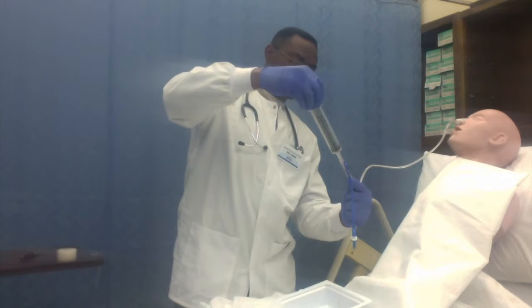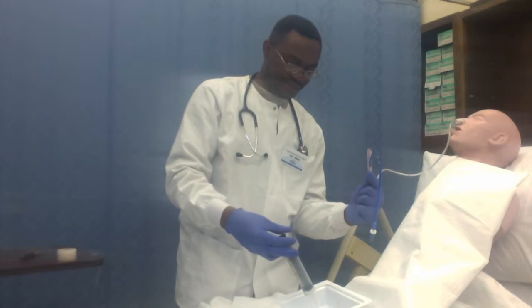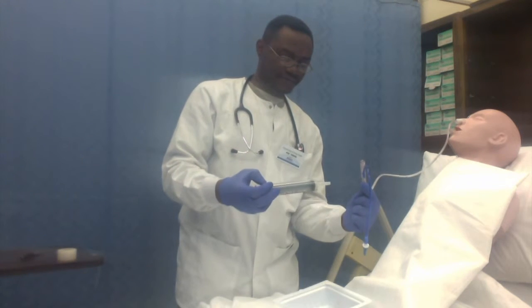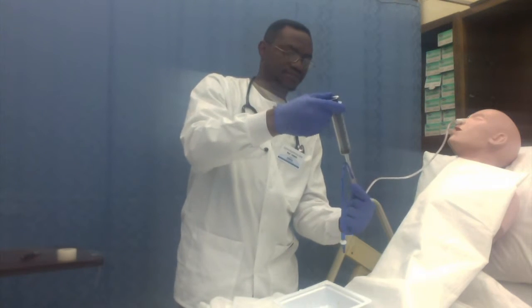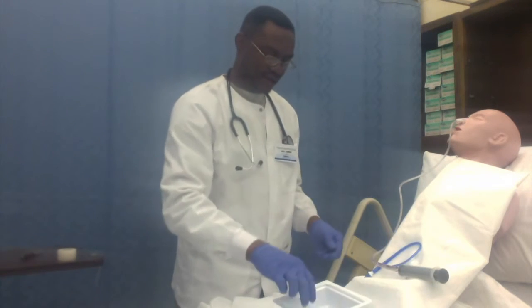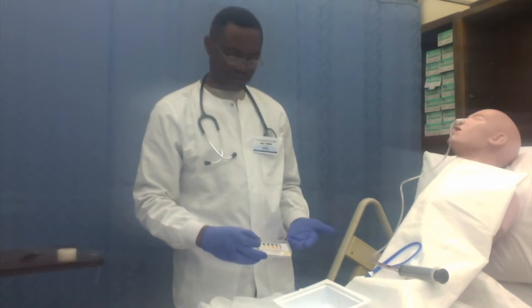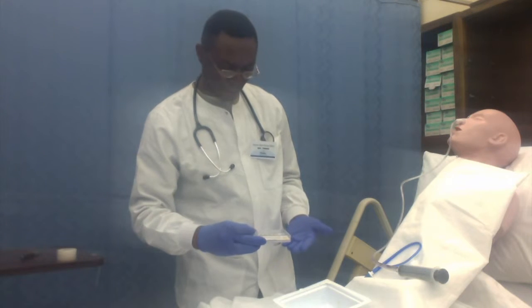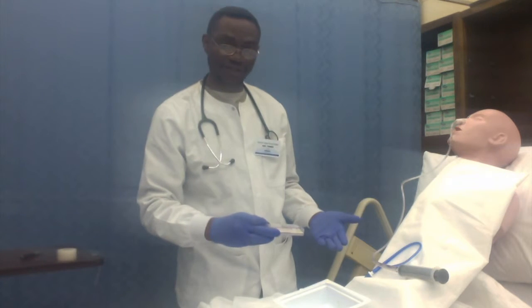I will aspirate a little bit of stomach content, put it on my pH strip, and verify my pH strip to be sure that the tube is well placed. If my pH strip reads between 0 to 4, I understand that the tube is placed rightfully in the stomach or in the gastric region.